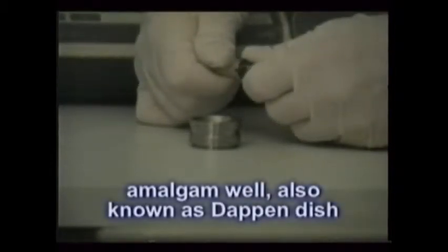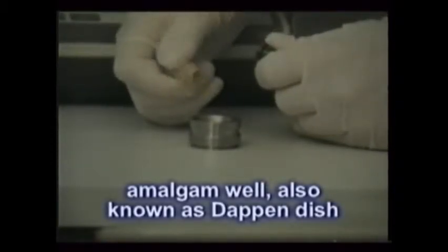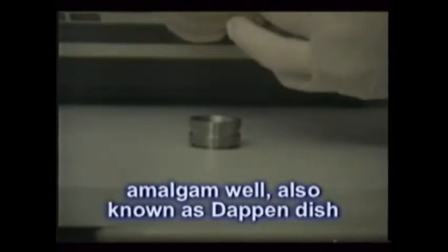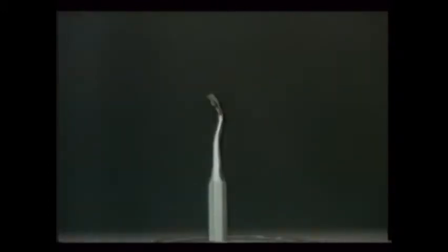The amalgam well, which is also sometimes called a dappin dish, holds the soft filling material and facilitates its loading into the amalgam carrier — a unique instrument that lets the dentist place the filling into the tooth. The condenser is a plunger-like instrument that is used to pack the silver filling down into the cavity preparation.